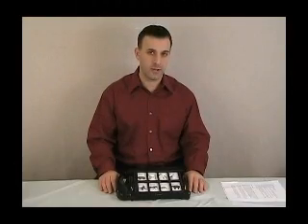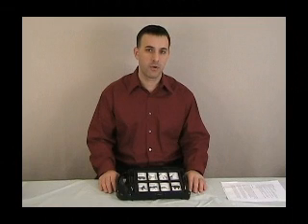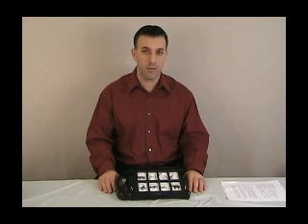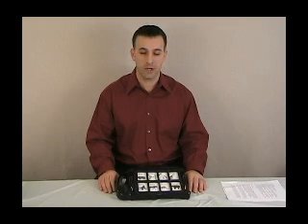One of our other frequently asked questions is, what would cause my 7-level communication builder, when it's in playback mode, to play a portion of the message only or completely cut off the message? Batteries, batteries, batteries. 99% of the time it's a battery related issue. When your batteries are weak in your communicator, a common problem would be messages cutting off midway through playback, or if they're extremely weak, maybe just getting a clicking sound, or the machine is completely dead.